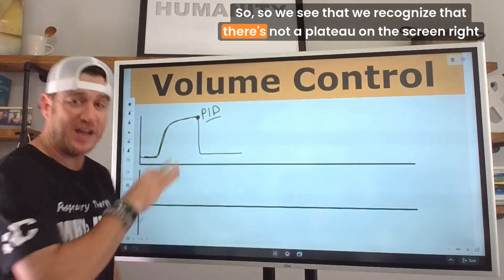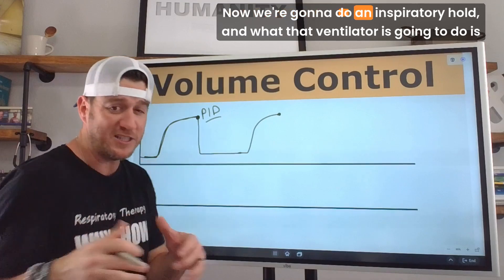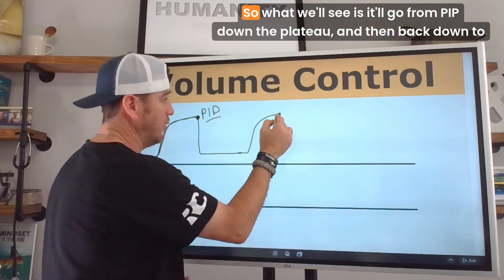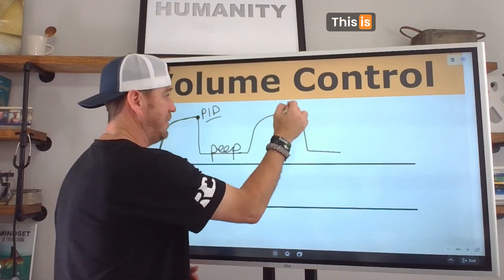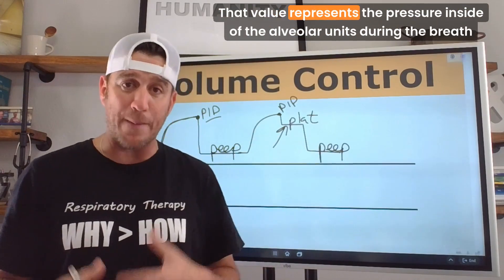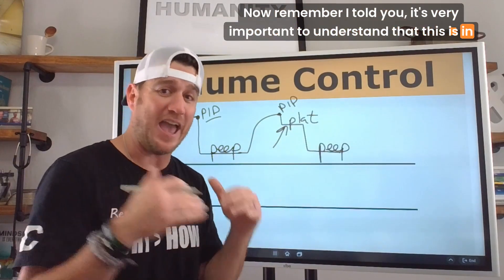We can see that there's not a plateau on the screen right now, but when we want to assess plateau pressure, we have to perform an inspiratory hold. The breath is delivered — that's peak inspiratory pressure. Now we do an inspiratory hold: the ventilator holds the breath within the patient's alveolar units. We'll see the pressure go from PIP down to plateau and then back down to PEEP. That plateau value represents the pressure inside the alveolar units during the breath hold, and this is assessed in the absence of flow.